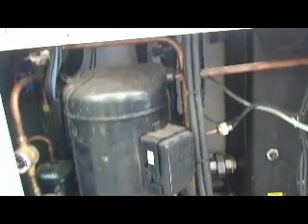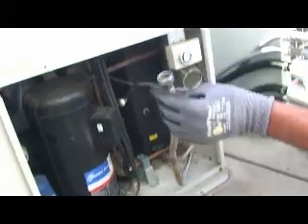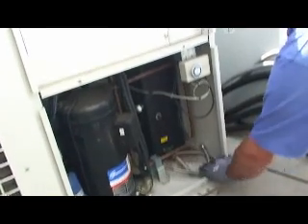This is a drain. If you have to drain the tank outside for the glycol to repair or replace a pump or repair something with the water section, you can shut the water off, drain your tank, and reuse the glycol that you take out of that tank.